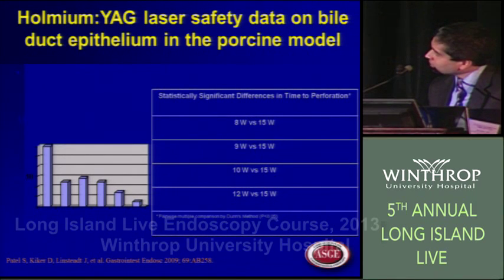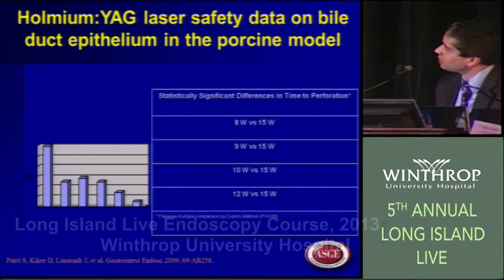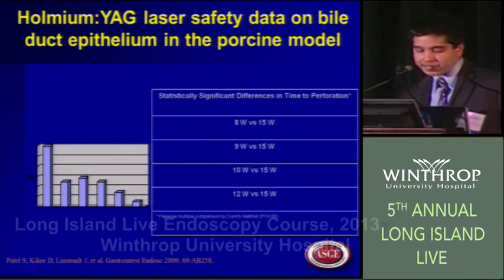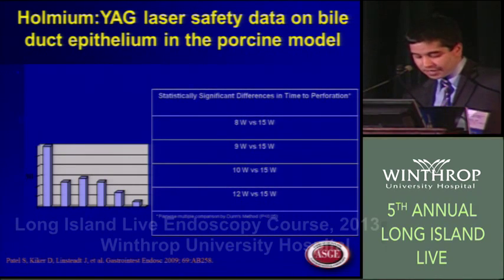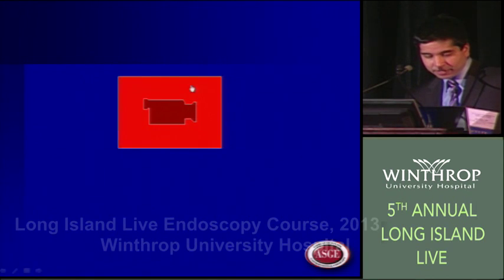So he tries not to go beyond 8 to 10 watts of power when you're using laser. And part of that is even well demonstrated in this abstract, which unfortunately has not been published yet in a peer review. But needless to say, it adds some significant information for us to what our safety margin may be in using laser in the bile duct. And I'll show you a quick video.